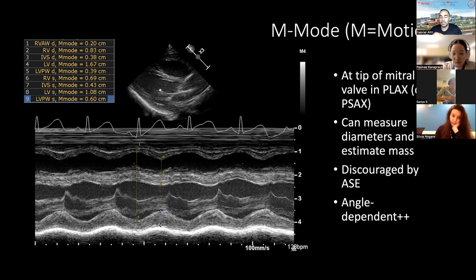It's used a lot in the POCUS literature because it's a very easy marker to get and it's been associated with cardiac function. So the closer it is and the shorter the distance, it's typically a better function. Don't quote me on this. I would have to just double check it, but I'm pretty sure it's that. I can validate just to make sure.